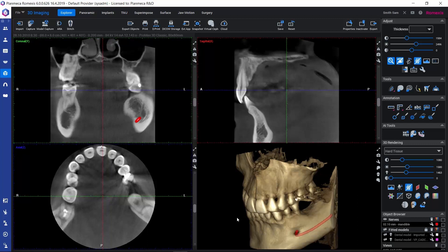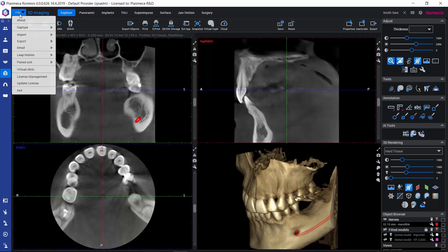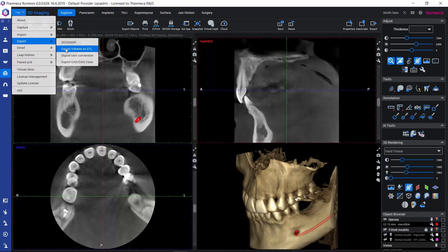First, let's open the 3D volume, and then let's go to the file menu that you can find here on the upper left corner of the screen. Let's open the file menu, go to Export, and select Export Volume as STL.